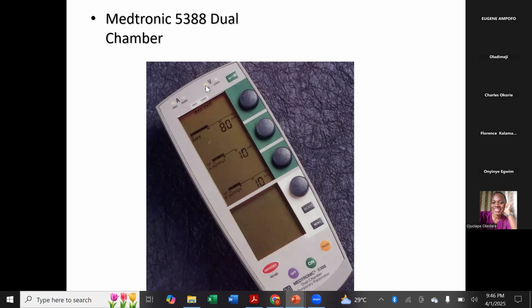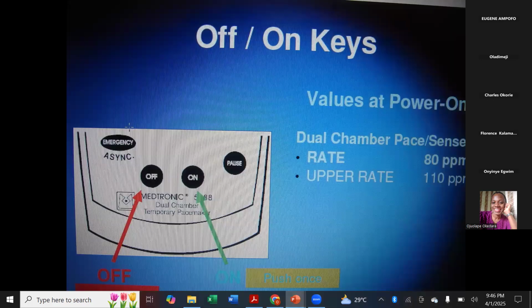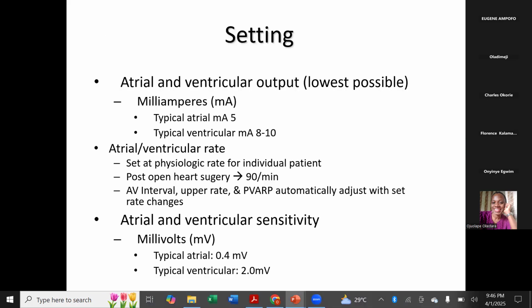If it's not sensing, you will not see the indicator generate lights. So it's important. It uses normal batteries, so you can choose any voltage rate. You are not afraid of consuming the battery. Okay, so that's what I'll bring out in the temporary pacemaker setting.